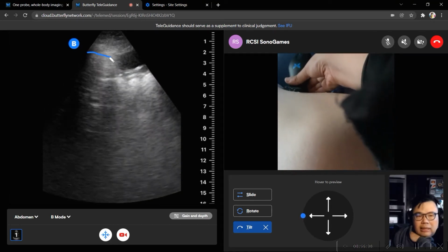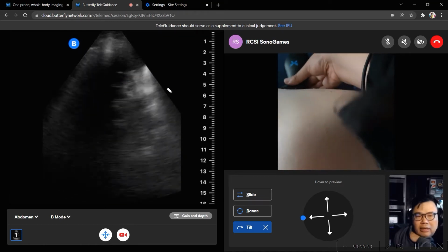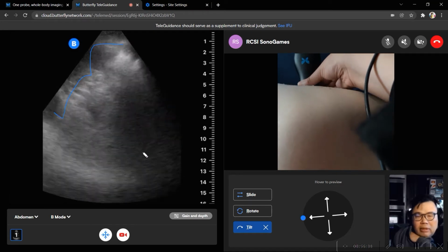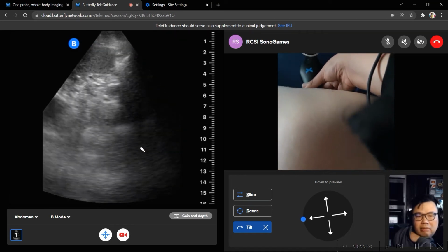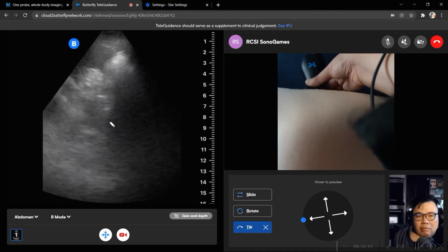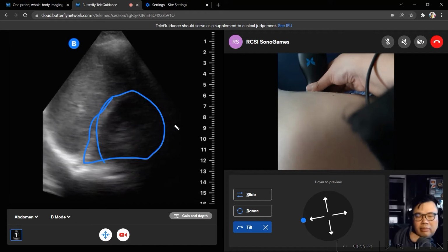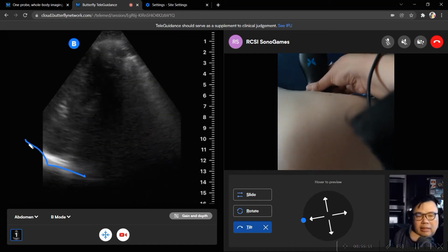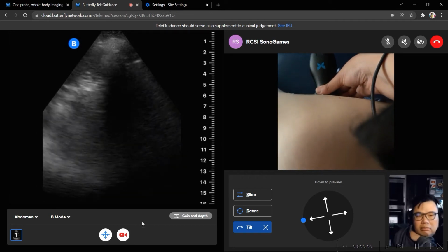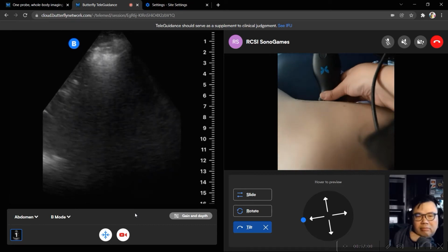Oh, this is lung now. We're doing lung ultrasound. Great. There you go. Okay, spleen. Now, how do we see the kidney? There you go. That's the kidney there. Yep. Okay, excellent. And then you see the spine, and then you clear the same again, above and below. Okay. Happy enough? Yes. Thank you.